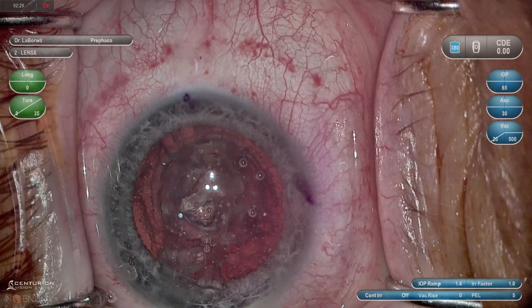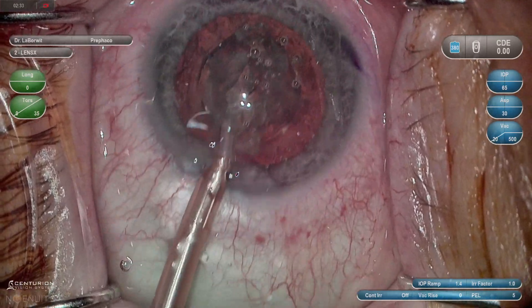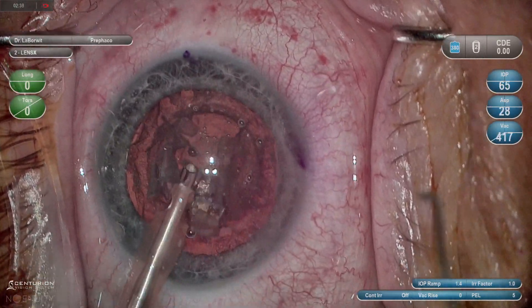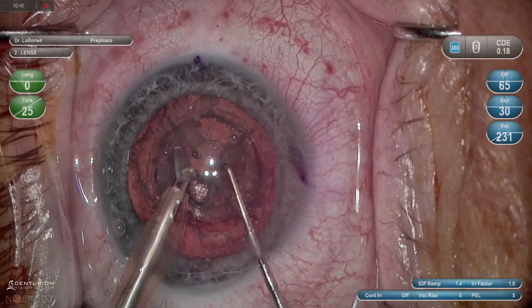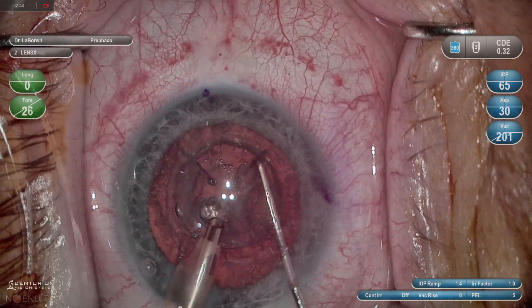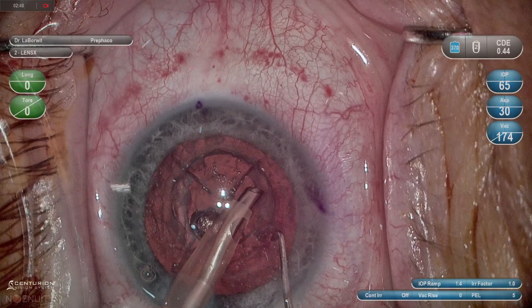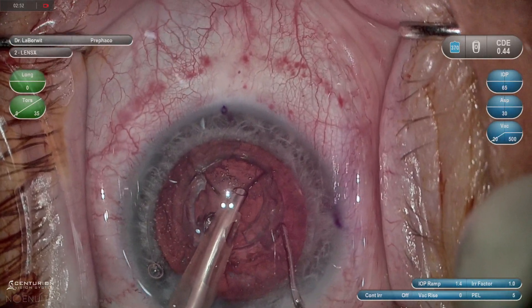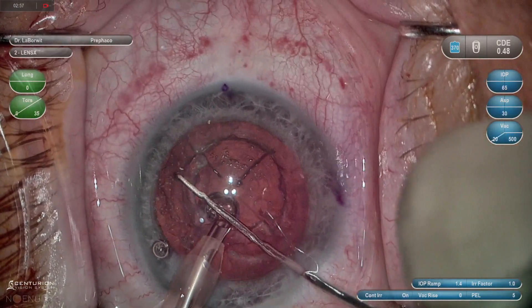Notice when I'm using phaco emulsification I'm able to leave the phaco tip parallel at the iris plane and not reaching beyond the capsulotomy. This keeps it in a safe position and allows it to function more like a trash can, where a second instrument — the Rosen chopper in this case — is used to bring the cut laser pieces up to the tip. The densest part of the cataract is therefore removed easily with less CDE in a safer manner.